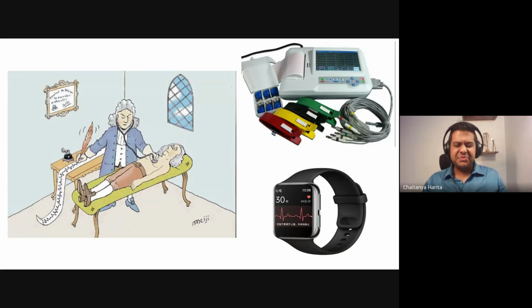But what I put in the bottom right is the Apple Watch, and there are a lot of smart watches, smart gizmos and gadgets now, which can detect a basic ECG right off your radial artery. And I've used a couple of these devices on patients. I've seen how they worked, and they're surprisingly accurate. Of course, the variations and the variabilities are high, but these are enough to at least tell me, especially for life-threatening arrhythmias.